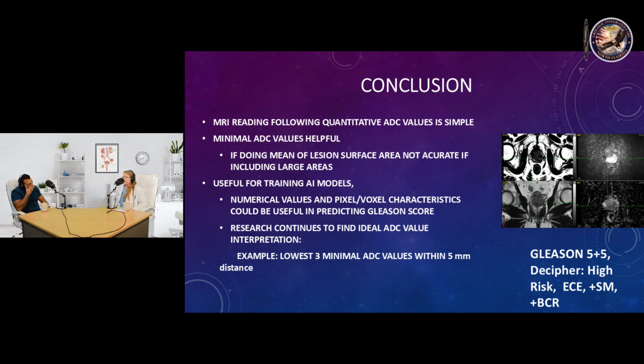I definitely look at the PI-RADS reading, and that guides me to the diffusion weighted image and ADC mapping. I have a big monitor in my office where I have the patients go over their own MRIs, and I explain the whole thing to them, and then they have the biopsy, and then we go to treatment. So the patient is very well informed. That's got to be great for the patient. It sure is. They love it. And some patients who are physicians themselves find it fascinating.